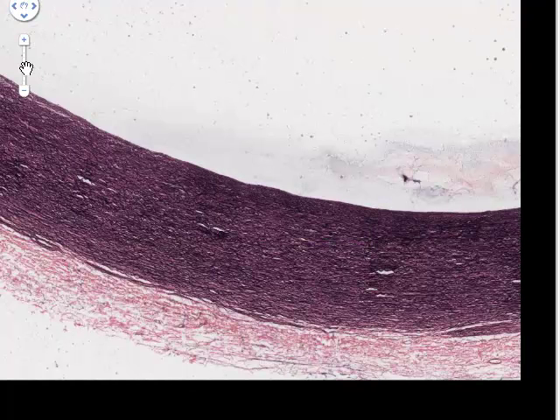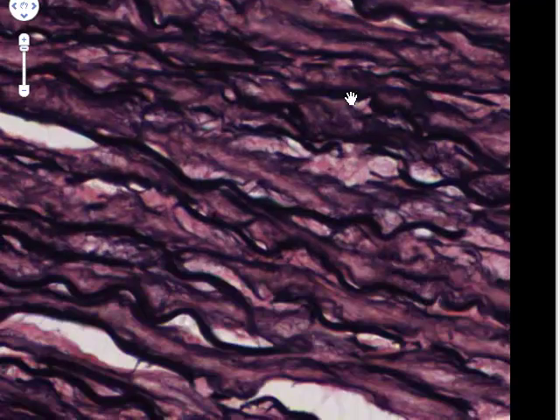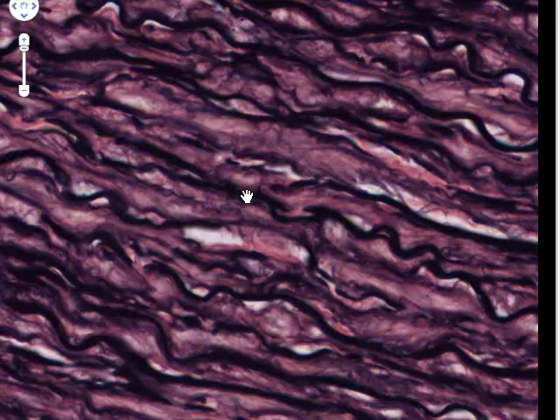Increasing the magnification, the dark wavy staining material you can see here is made up of elastic fibers packed together into sheets called elastic lamellae. 'Lamella' is the Latin for sheet. These sheets of elastic material are interspersed between muscle cells, which we can't clearly see right now because of this special stain. Elastic lamellae are really only found in large elastic blood vessels.